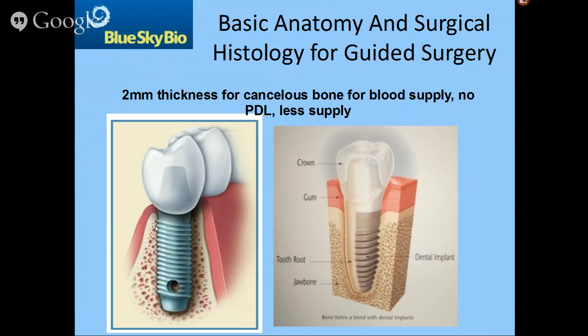So that means after the osteotomy, all that's left is the flap of tissue above it and the cancellous bone. If there is a surgical flap on the outside of the case prior to placing the implant, then that can be violated as well. So you're only left with cancellous bone in those circumstances. And that's why having 1 millimeter is not perhaps the correct number. I always shoot for 2.